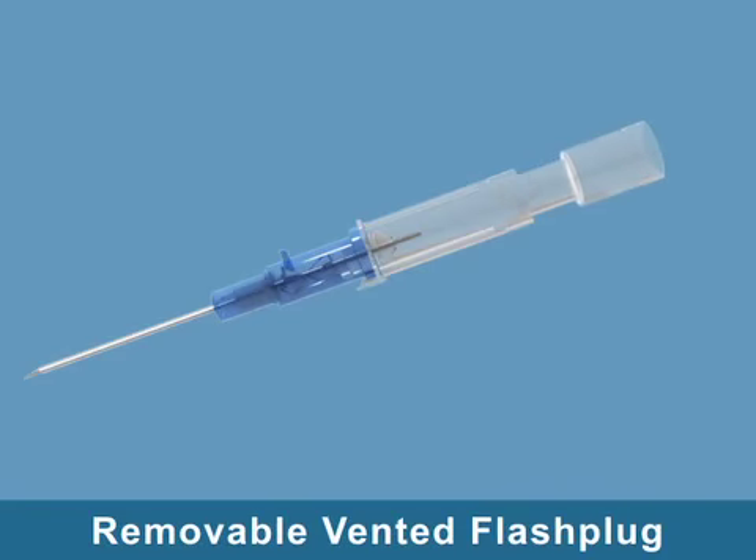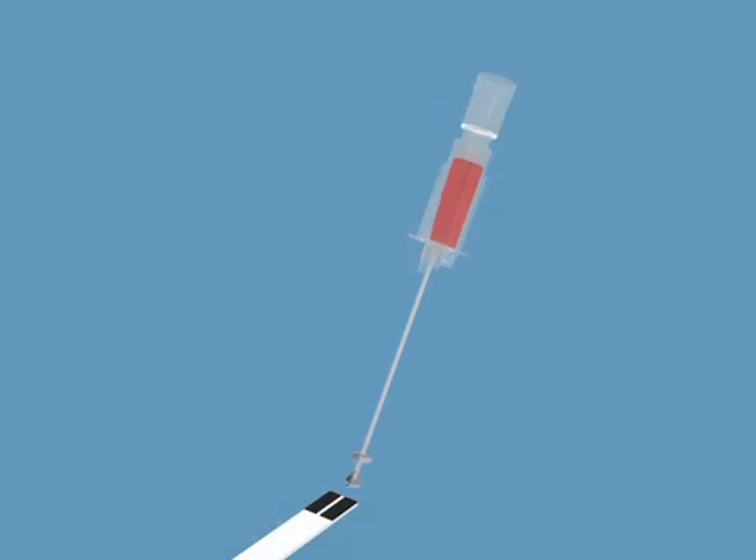The removable vented flash plug provides additional versatility to the Intracan Safety IV Catheter. The flash plug can be replaced with a syringe or blood collection access device prior to insertion, or loosened to speed blood return during catheter insertion. After needle removal, this feature allows the clinician to obtain a droplet of blood for procedures such as monitoring glucose or hemoglobin levels.